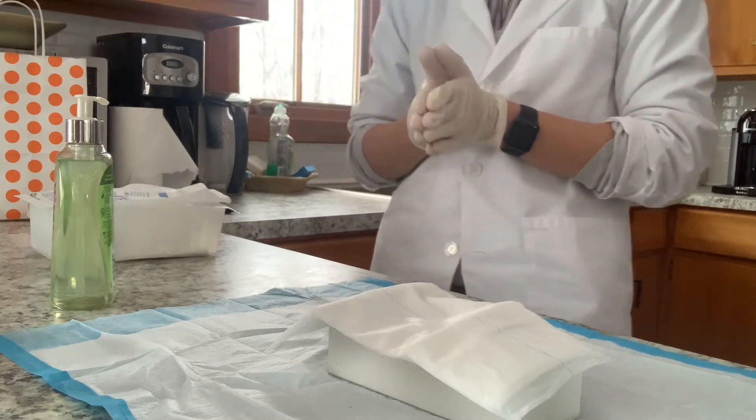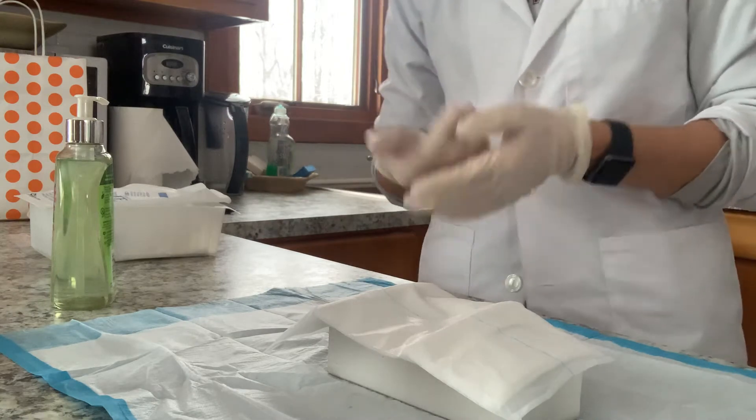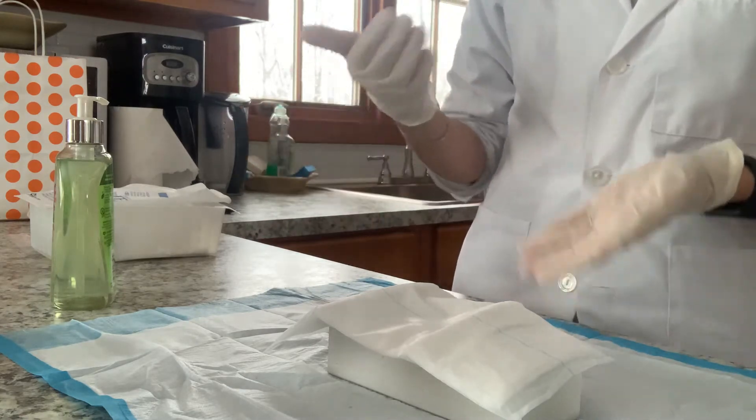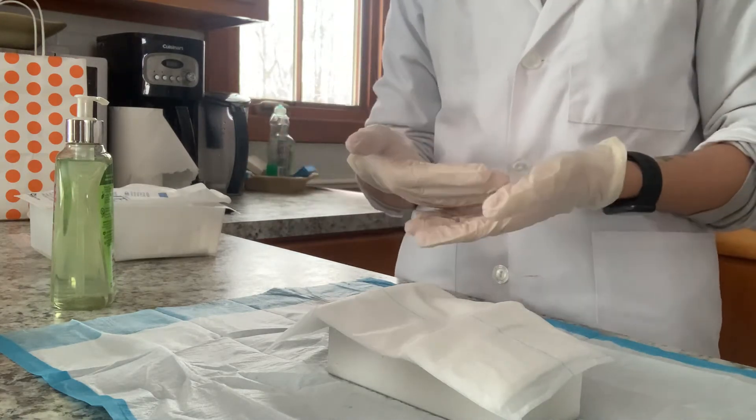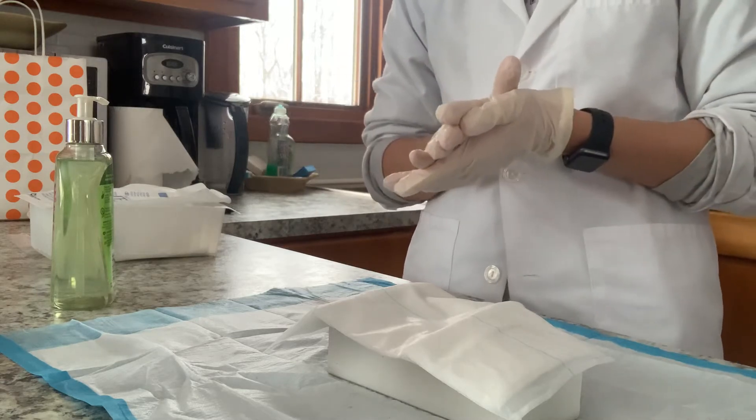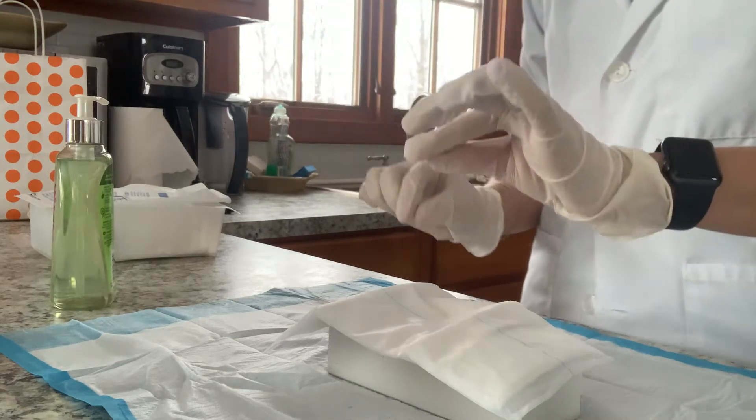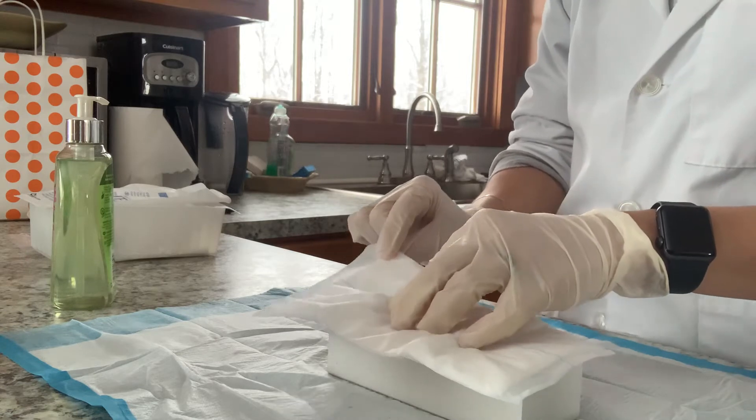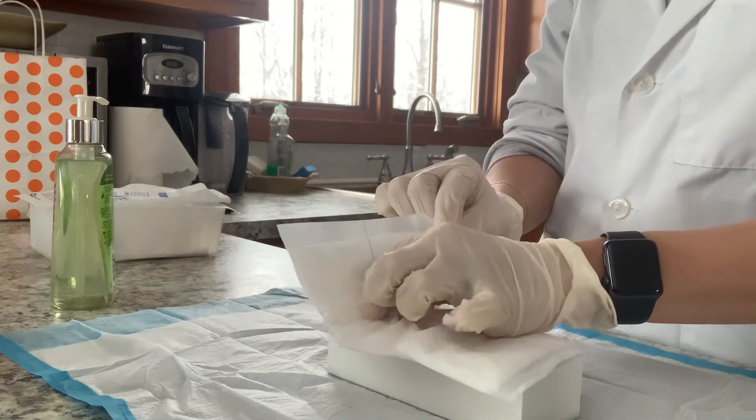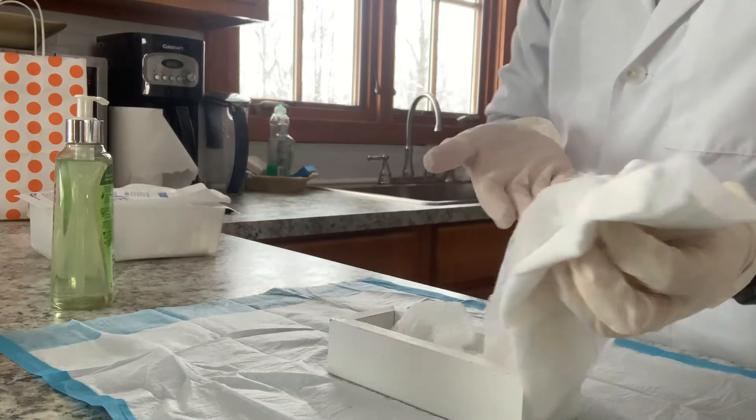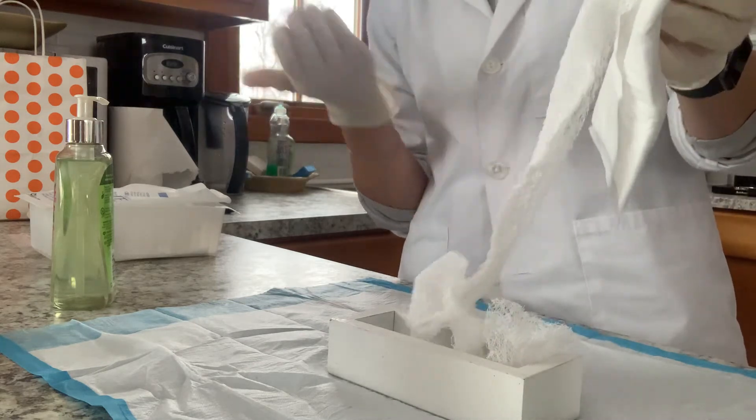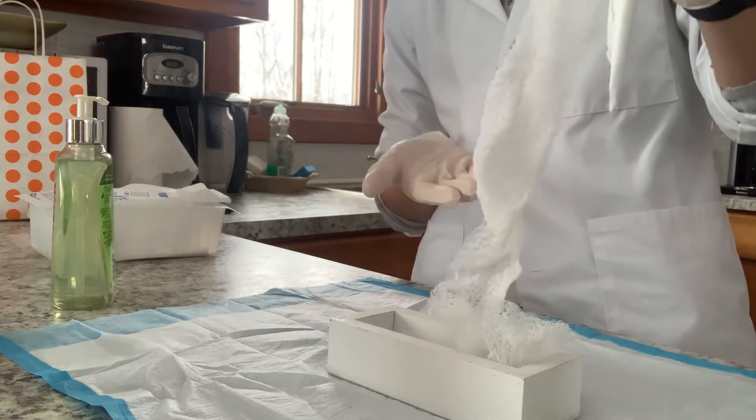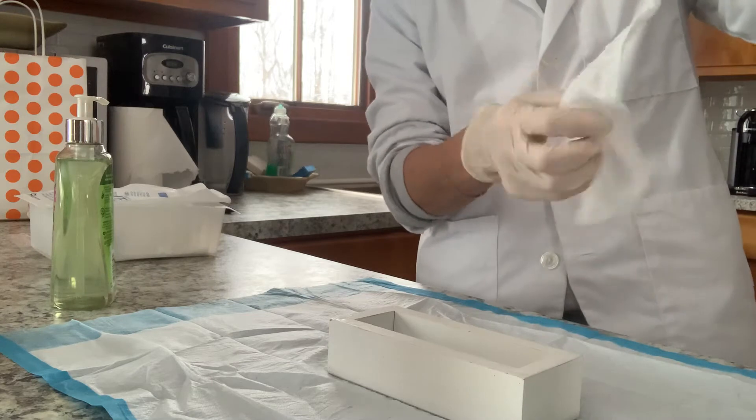I only have one pair of clean gloves, so I am going to have to reuse these a couple of times because the other pair ripped. So I would have the patient positioned so that it was easier for me to take the bandage off with the least amount of discomfort possible. I would gently pull up the tape and hopefully if there was a tail, the bandage would come out with no problem. I stuffed that in there.